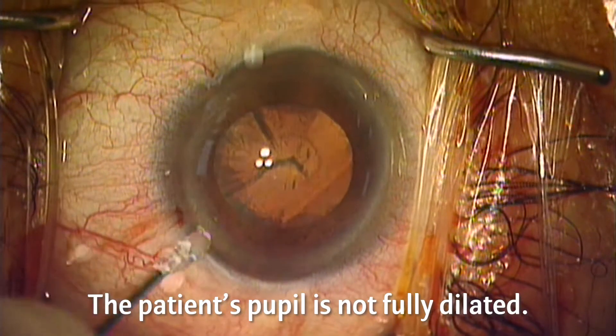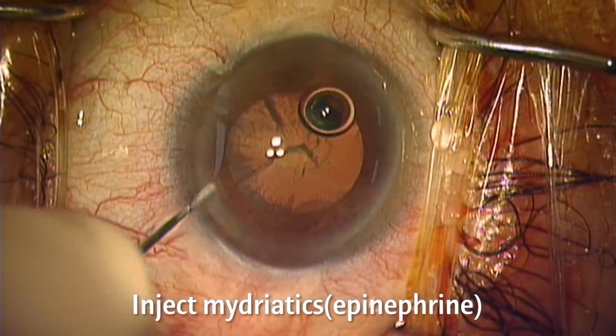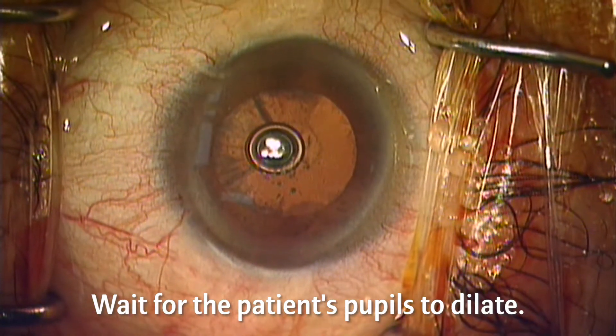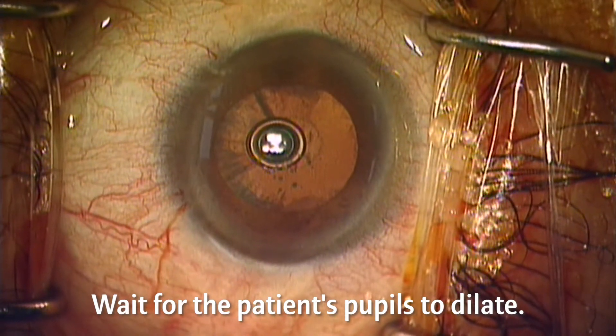This patient's pupil is not fully dilated. So, for safe surgery, epinephrine is injected. After injecting epinephrine, it is common to wait for the drug to take effect. However, there is a simple way to quickly spread mydriatics to shorten cataract surgery time.